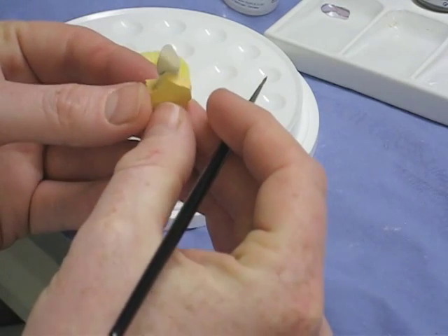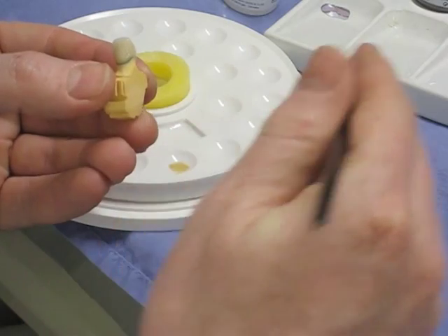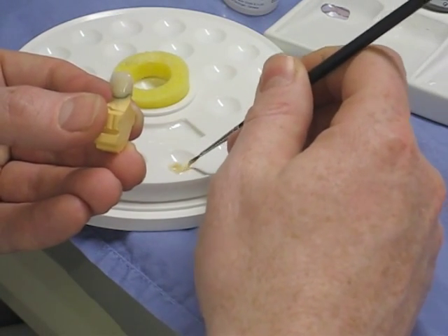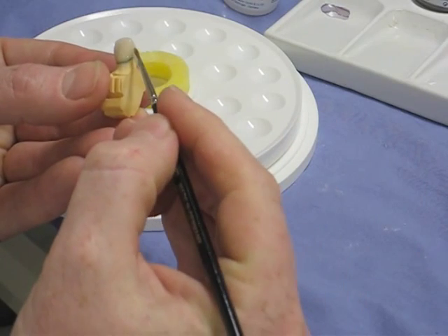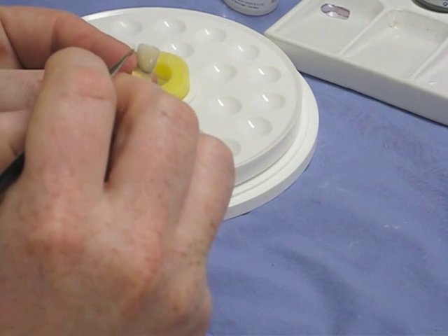The function of the glaze, other than just appearance, is that it makes the crown hygienic by sealing up all the porosities in the surface of the crown, and it also strengthens it by sealing up those porosities as well.